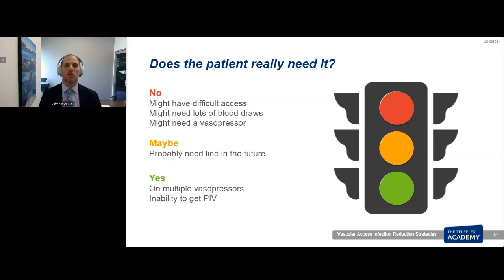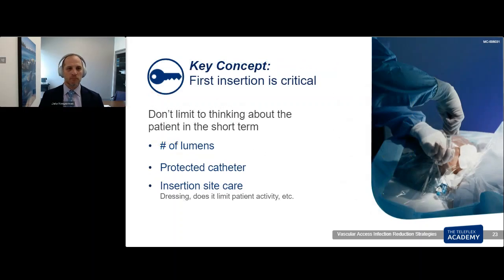Yes, a patient on multiple vasopressors needs a central line. A patient where you can't get any other kind of IV access is likely going to need a central line. So place it. But again, place it correctly, and place it correctly the first time.